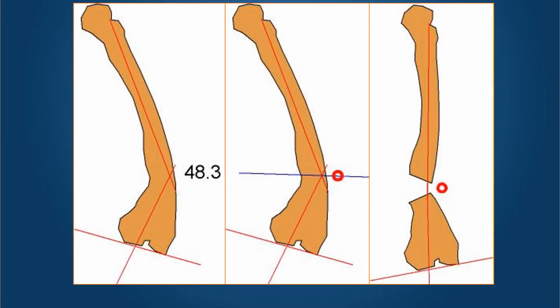Then we use the deformity plane X-ray to simulate the surgery to determine the shape of the osteotomy and where to place the hinges. So we have drawn the proximal and the distal axes. They intersect in the transverse bisector line, and by placing the hinge away from the convex cortex and performing the corticotomy on the apex of the deformity, we are able to achieve not only a correction but also lengthening by opening up a trapezoidal shaped wedge like so.